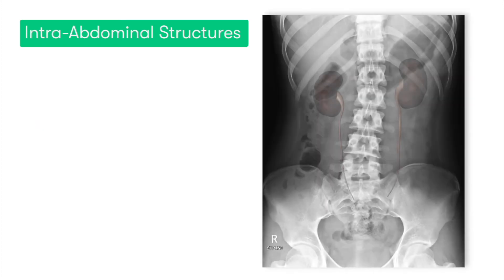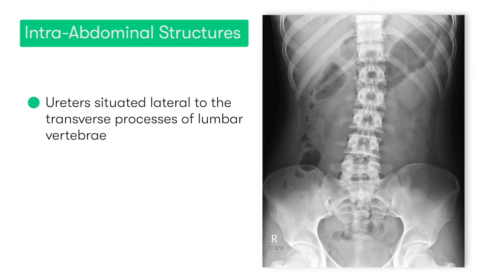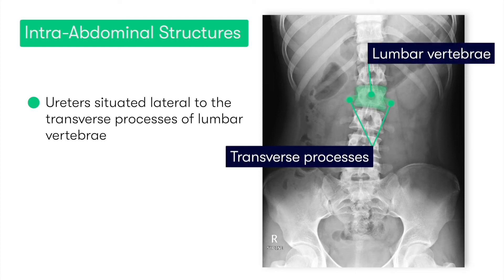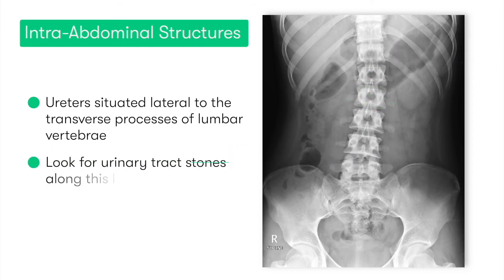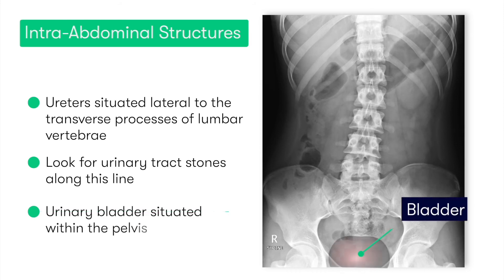Moving back to the kidneys, we have the ureters, which come off the renal pelvis on the medial aspect of the kidneys. The ureters run inferiorly down to the urinary bladder, along a course which roughly approximates with the lateral points of the transverse processes of the lumbar vertebrae. It's along the course of this line that we look for the presence of any radio-opaque urinary tract stones in patients who have acute abdominal pain. And finally, lying within the pelvis, we have the urinary bladder, which we can see here.